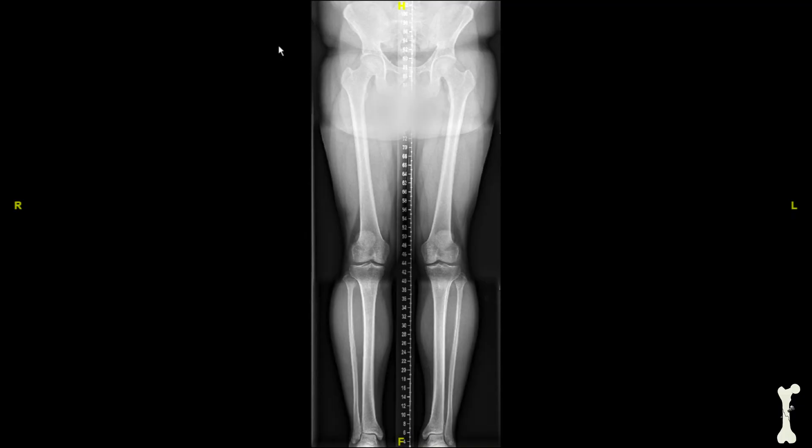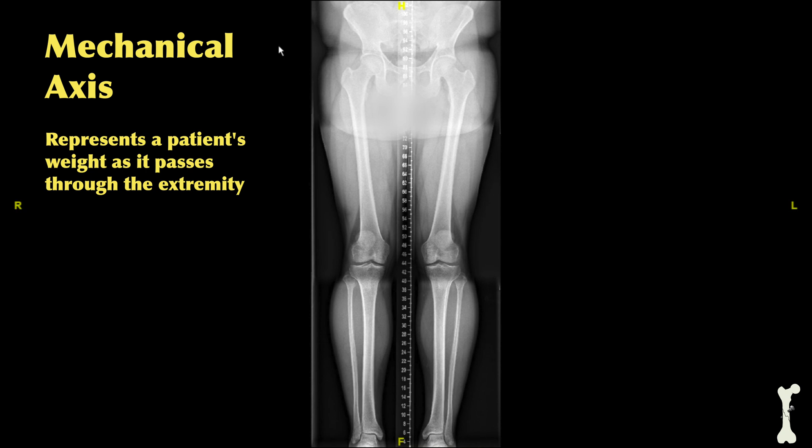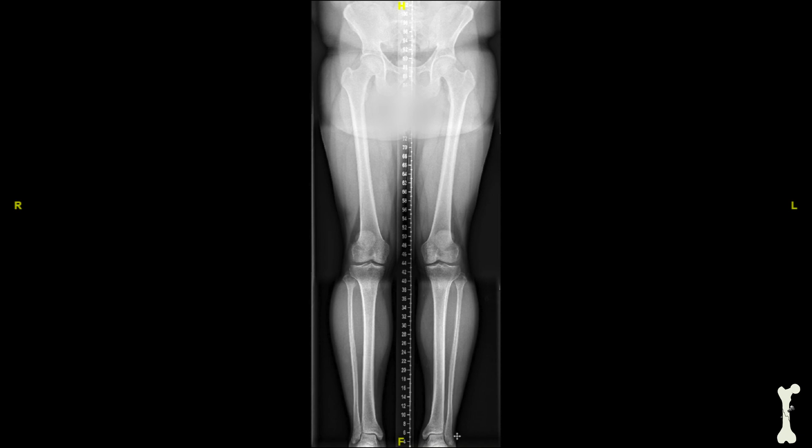Here we're going to look at the mechanical axis for this particular patient. You'll notice that these x-rays include the pelvis, the hip joints, the knee joints, and all the way down to the ankle — it's important to get these x-rays so you can see the entire extremity. To determine the mechanical axis we'll start at the center of the femoral head and draw a line down past the knee joint to the center of the ankle joint.